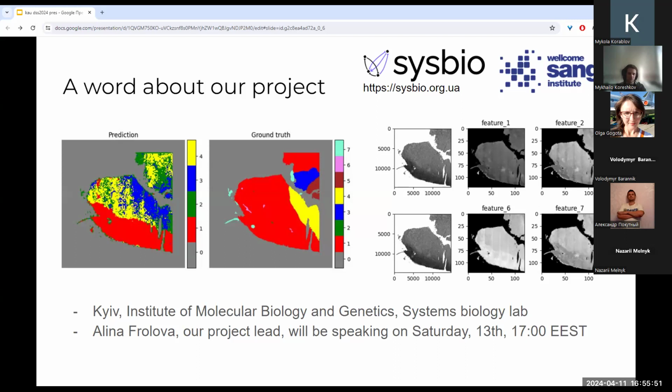We are working with biological photographs, microphotographs of small slices of human tissue, and we are trying to find biologically significant features in these tissues. For example, to find which part has more infection and which part has less, or to find different types of tissue in an image.